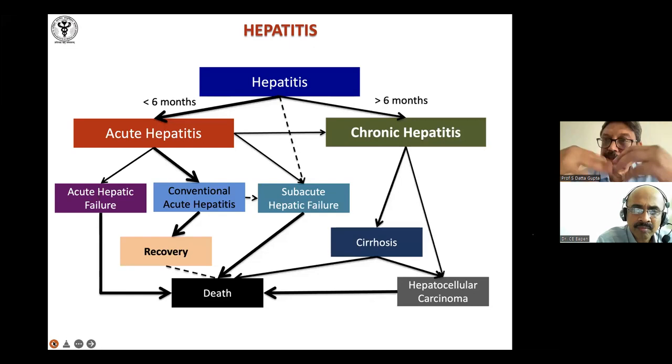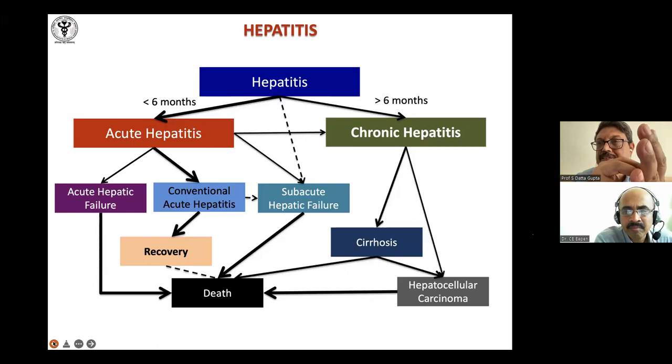They are mainly in the portal tract. From the portal tract, fibrosis may extend here and there, or for example around the terminal hepatic venule there is very little collagen, just a thin line around the vein. On the other hand, in alcoholic liver disease or in Budd-Chiari, you'll find a lot of this collagen laid down there. So that's how it helps. That's why we do both.